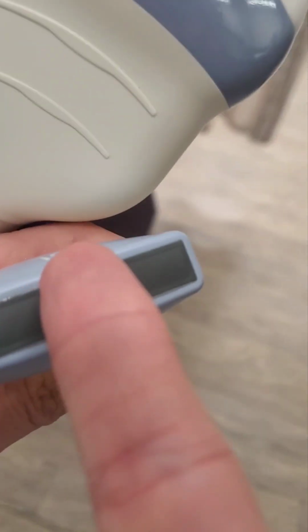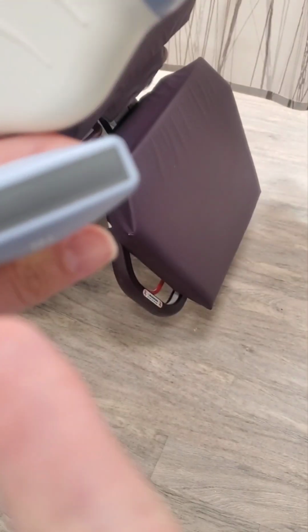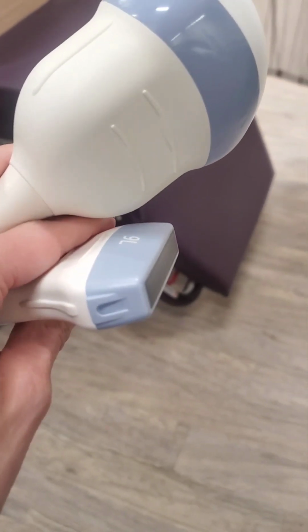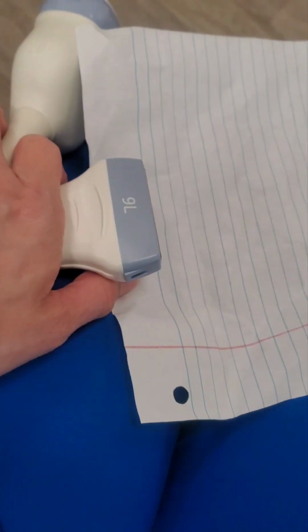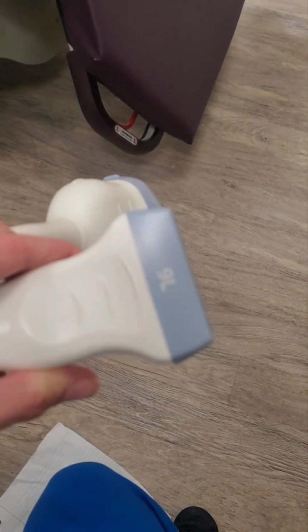This height here on that faceplate, the more height, the more that it can narrow together, and the better the slice thickness, that elevational. Right, here comes my sound beam coming out of my transducer. So we have that slice thickness of the sound beam, the lateral resolution, and then that axial resolution going to be how that sound beam pulses out from here going away, right?